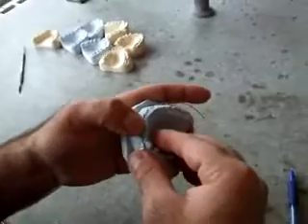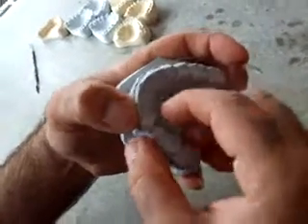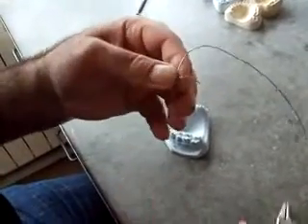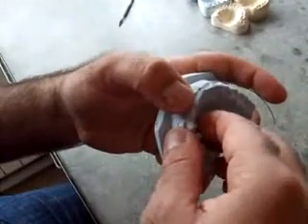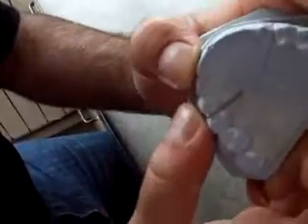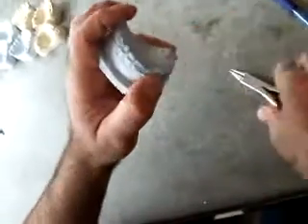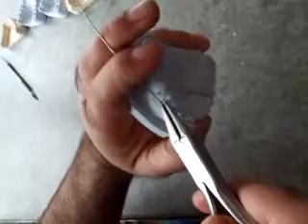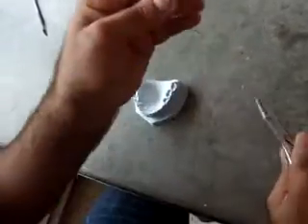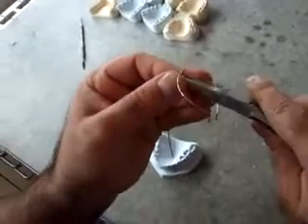Now we check. Then we continue to the other side, the same as we did on the first side — to the middle of the canine, make a 90-degree bend, then do a loop to the same level as the first one.